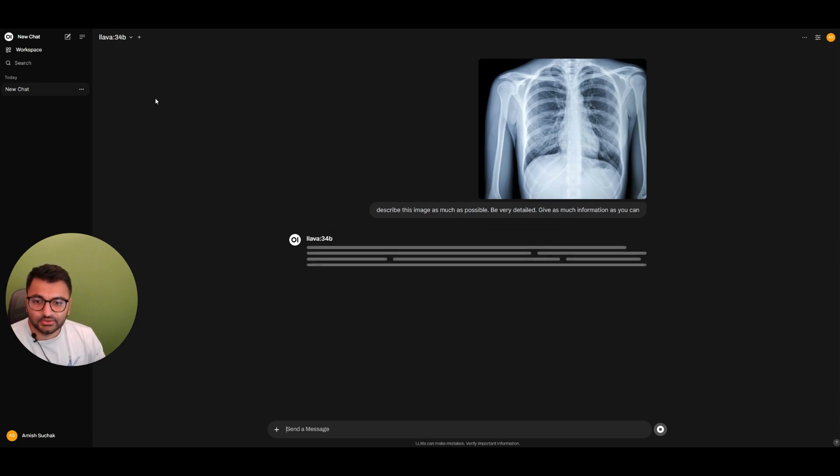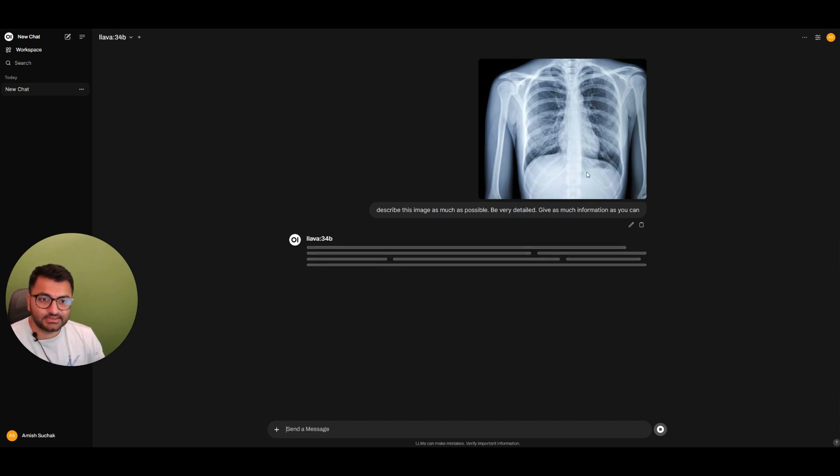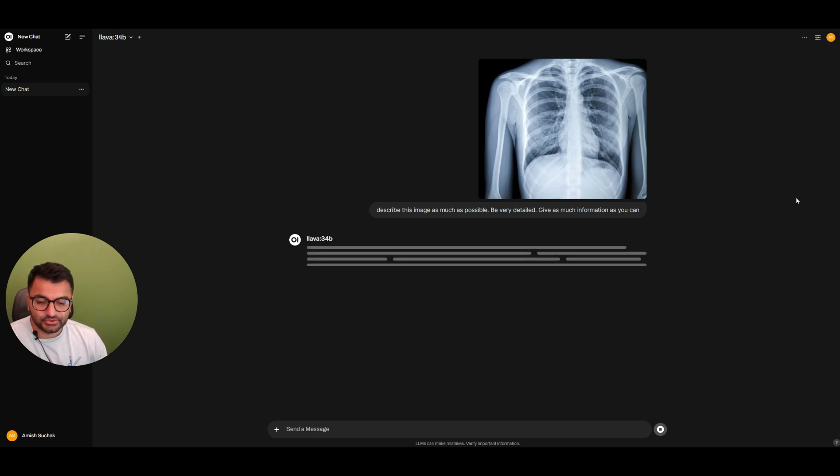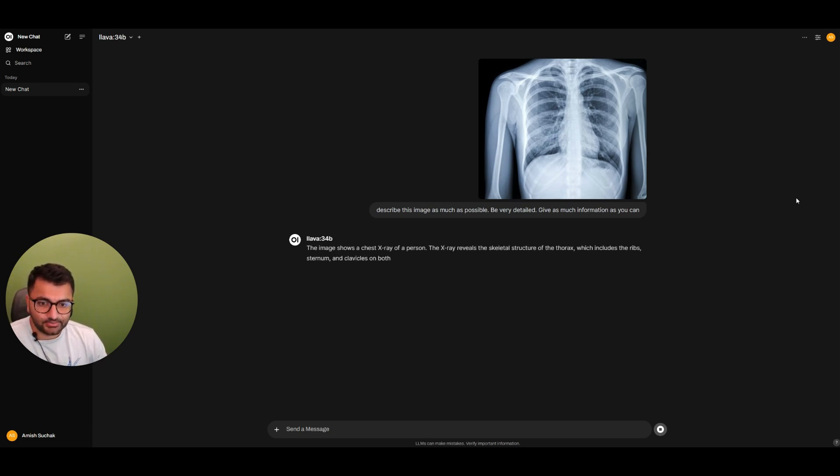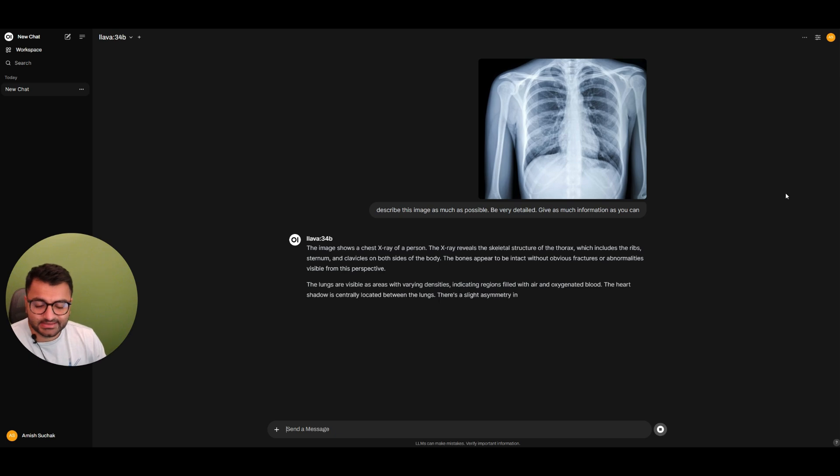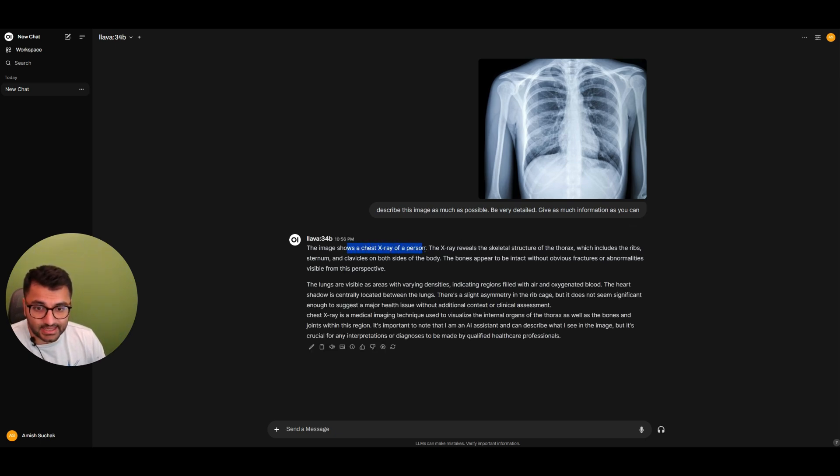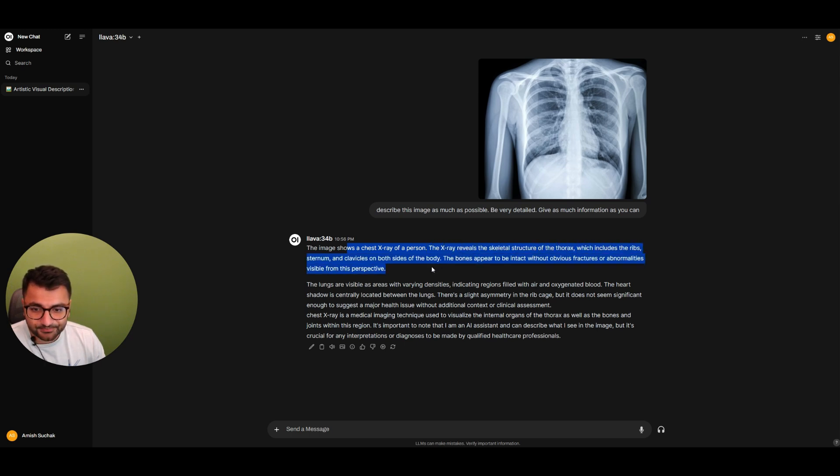So this is going to end up taking a second, especially the first time that you're running it, because it is actually going to have to load that model into memory. So just the first time that you actually run this model, it will take a while. And we can see that it is actually able to detect that this is an image of a chest x-ray of a person.